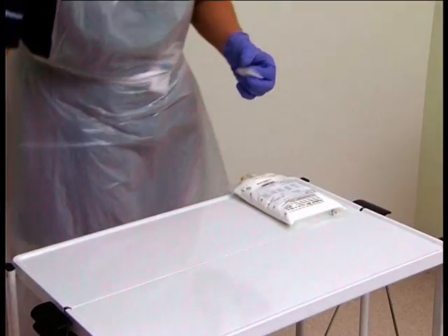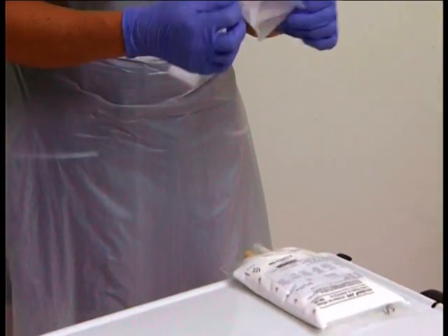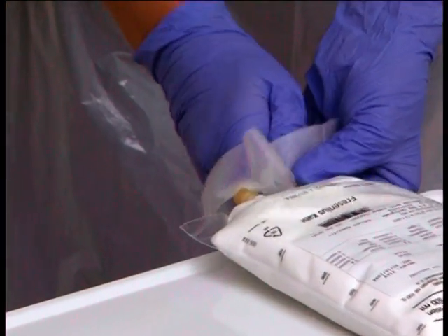Using a CHG wipe, clean the connection port where it will break open for 10 to 15 seconds, ensuring adequate application of the alcohol and chlorhexidine.